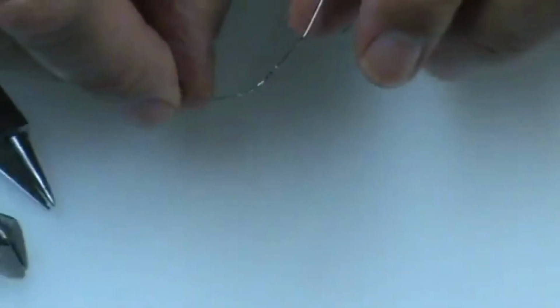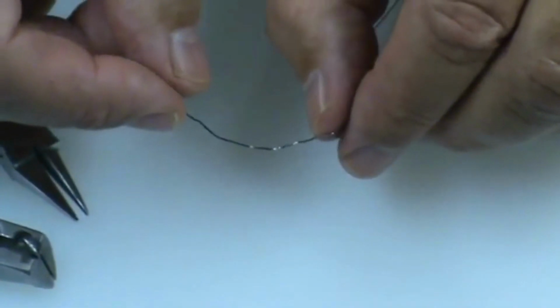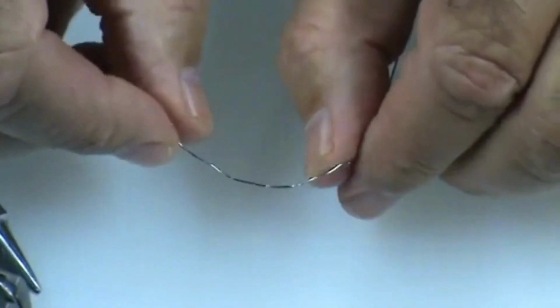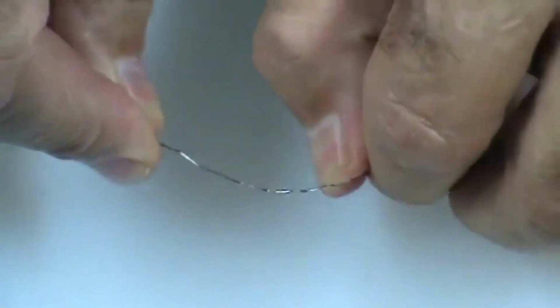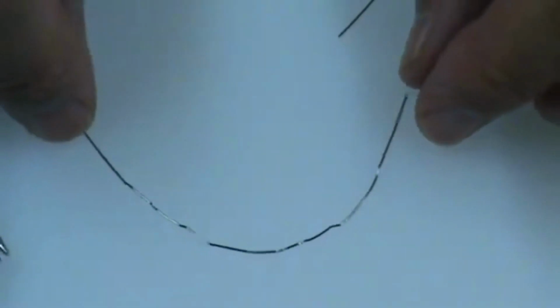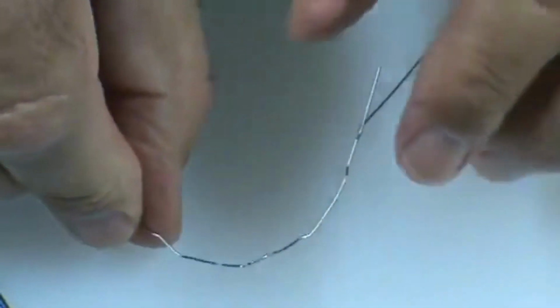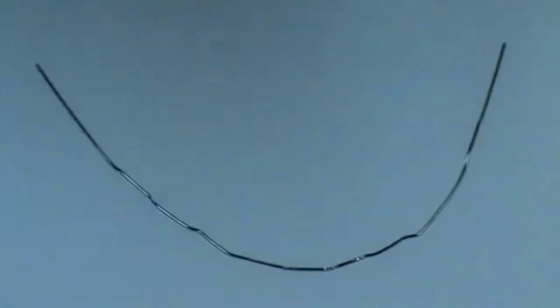Okay, so what I'm going to do is I'm going to take it in my fingers like this. Now I'm going to press in with this finger and I'm going to push out with that thumb to skew the wire to the left. Okay, you see that? All right. And now the wire is skewed to the left. That's what you do. Just take your fingers and try to move it. So it's not symmetrical anymore, okay? It is lopsided, in on one side, out on the other.